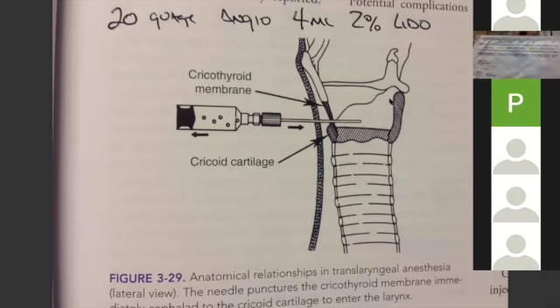So what is a Seldinger tray? Seldinger means that you have a lumen, you put a wire in it, like we do central lines, then you make a skin nick, dilate, and put the device in. So that's Seldinger. So Melker was a pediatric cardiologist who designed this. And so a lot of times you'll see it called a Melker cricothyroidotomy tray. And a lot of times you'll see a Seldinger tray like this one. This one's made by Melker Universal, go figure, okay.